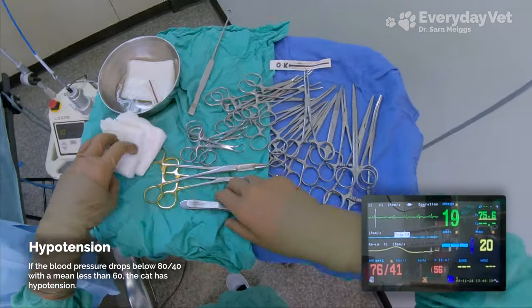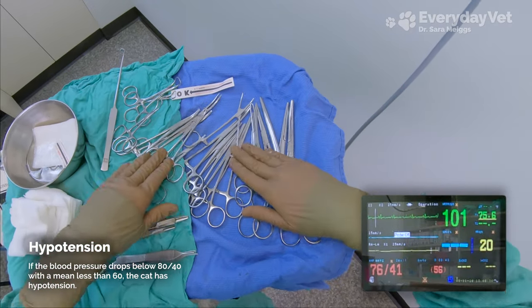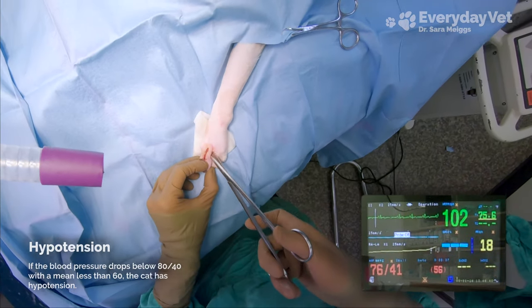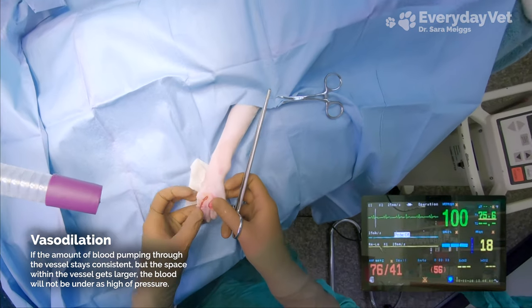We just got started, but take a look at that Cardell — he's already got low blood pressure. The sedatives that I give before the surgery, as well as the gas inhalant that he's on now, all cause something called vasodilation, which means that the blood vessel gets wider, so it's not putting as much pressure on the blood anymore.